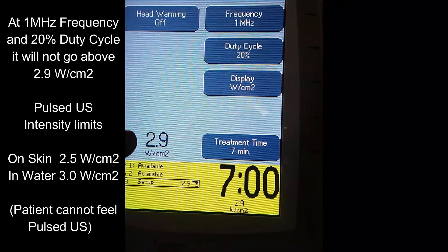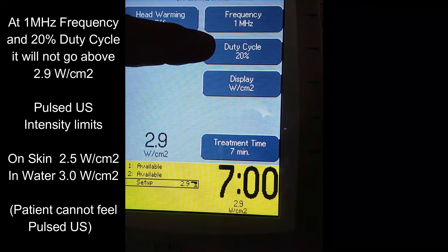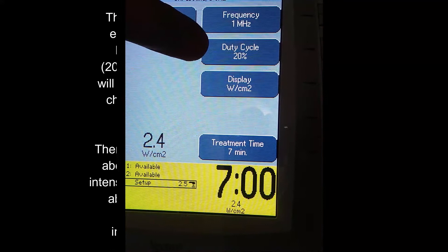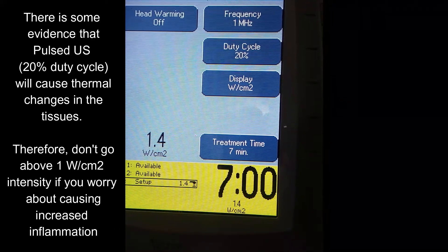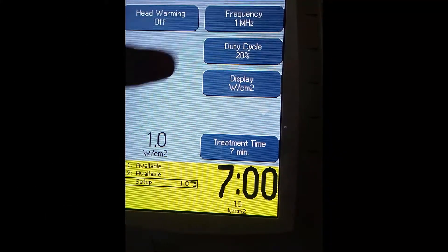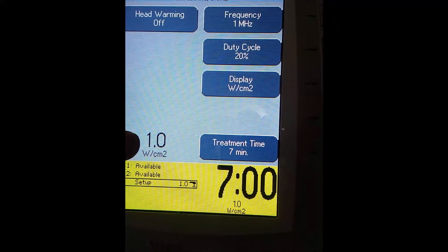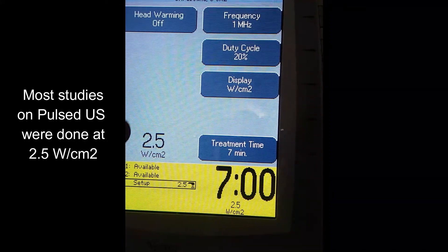The maximum we recommend is don't go above 3 watts per centimeter squared. Remember, patients do not feel pulsed ultrasound, so you've got to work within these numbers. One last mention: pulsed ultrasound does have a little bit of a thermal effect. So if you're worried about any swelling, you might not want to go above the 1 mark because, again, they can't feel it. If you're worried about the thermal effect increasing swelling, limit your intensity. Most studies on the effectiveness of pulsed ultrasound, however, were done at 2.5 watts per centimeter squared.